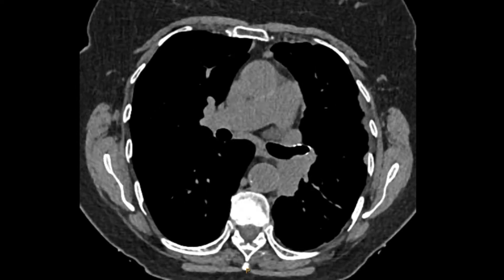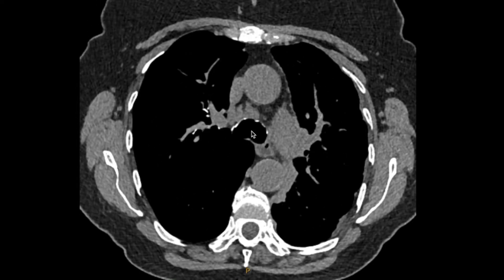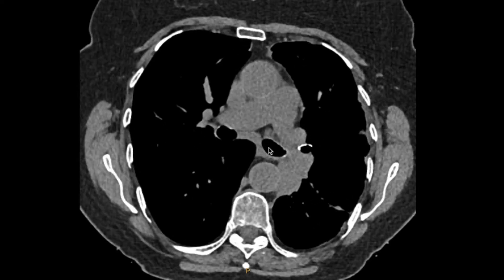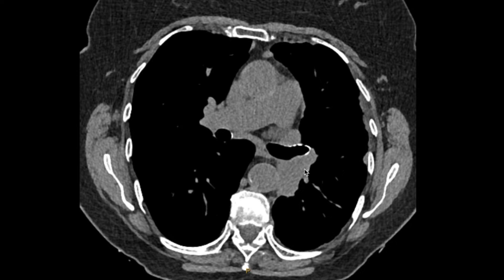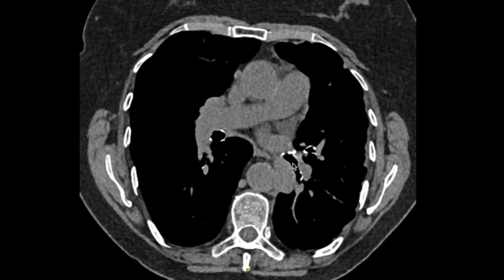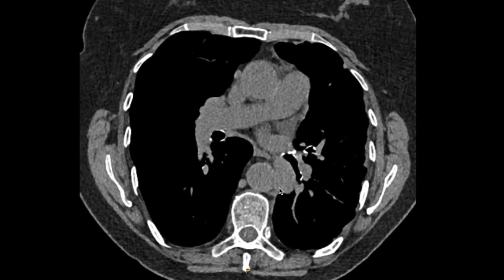If we have a look at the airways, here's the trachea branching into the left main bronchus. As the left main bronchus comes down, here's the left upper lobe, and here is the lesion. The left lower lobe bronchus appears normal and this lesion is medial to it. It may be a lung lesion, but given all the other pleural lesions and its position right next to the aorta, it may well be a pleural lesion. This provides a good spot for bronchoscopic biopsy with EBUS — the scope could sit in the left main bronchus or proximal left lower lobe and visualize and needle this lesion.